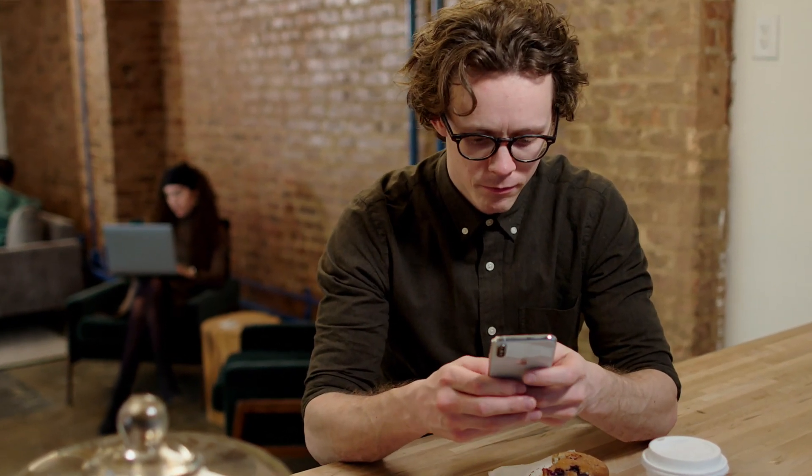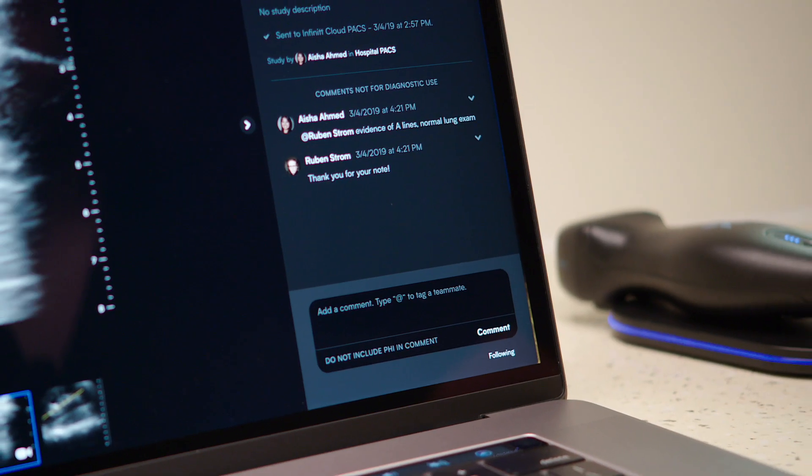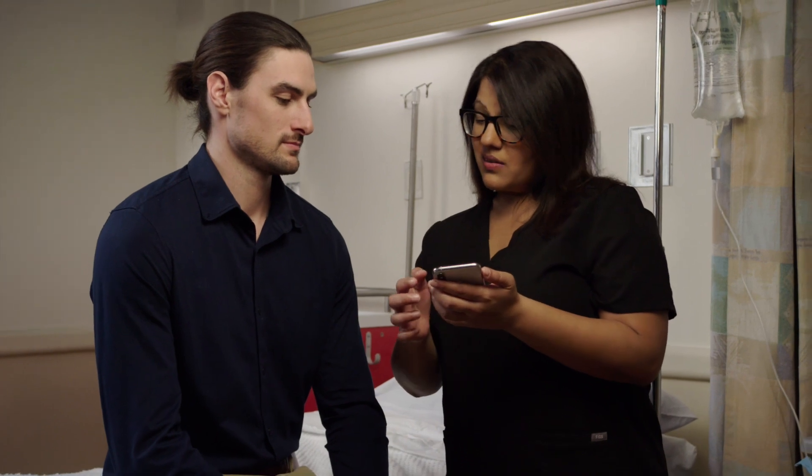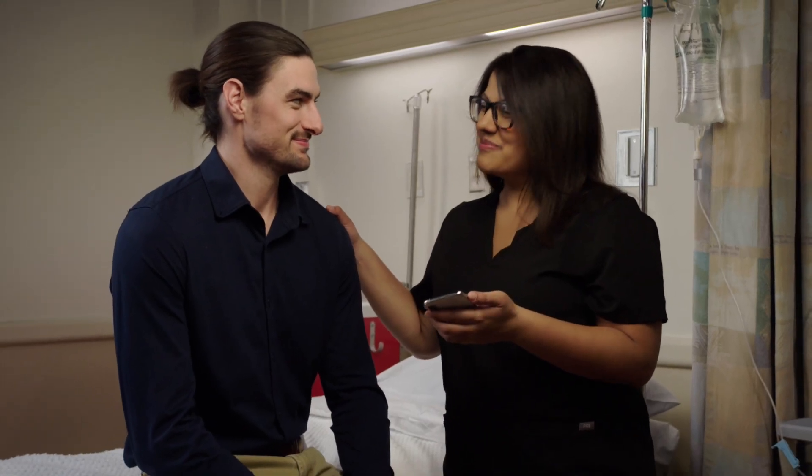Instantly share your studies with teammates no matter where you are. The beauty is that everything is connected. This is more than a revolution. This is personal ultrasound.